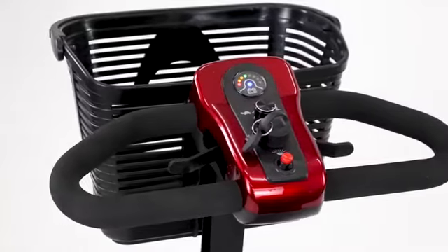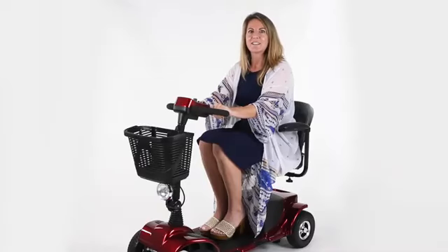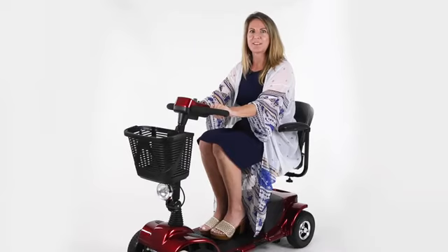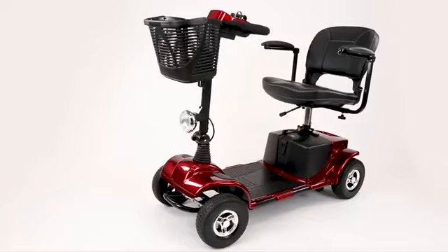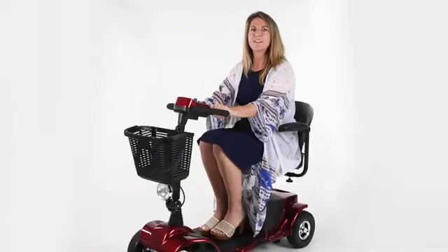Its industry-leading long-range battery lasts up to 15.5 miles per charge, averaging an extra 3 miles more compared to the mobility scooters on the market. Its near 9-inch wheels and shock absorbers make it ideal for both indoor and outdoor navigation, creating a smooth and comfortable ride over any bumpy terrain.